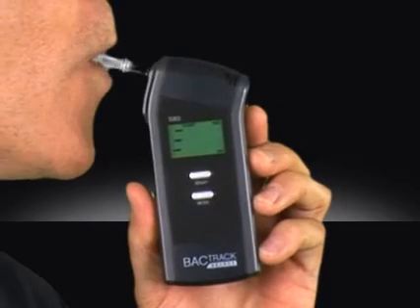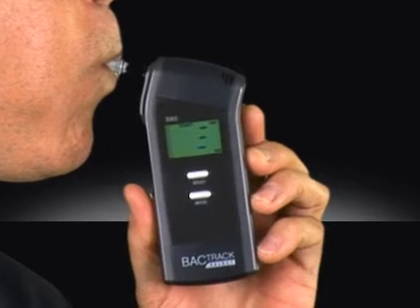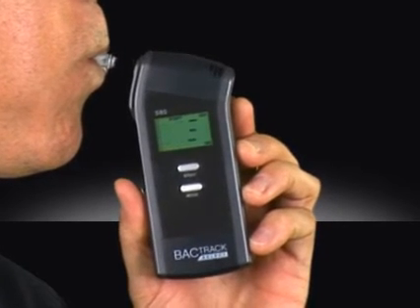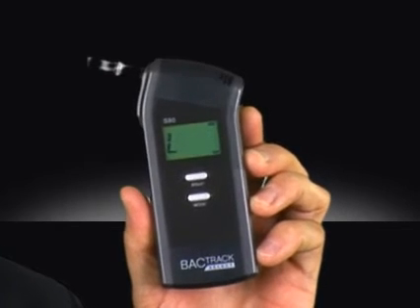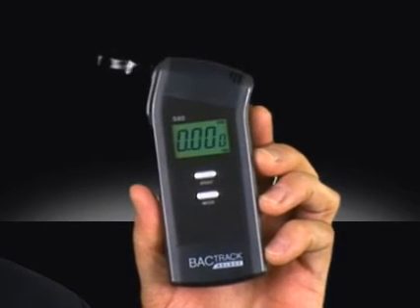Just insert a mouthpiece and blow for five seconds. Results are displayed to three decimal places and appear instantly.